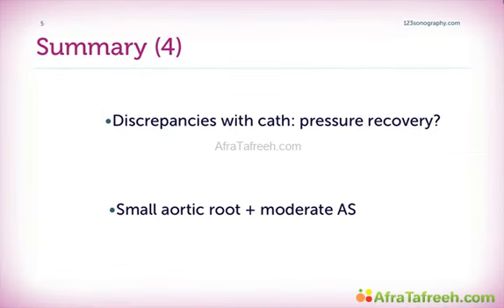Discrepancies of cath lab and echo measurements can sometimes be explained by the phenomenon of pressure recovery. Clinically, this is important to remember in patients with a small aortic root or in moderate aortic stenosis, and is frequently encountered in small women.